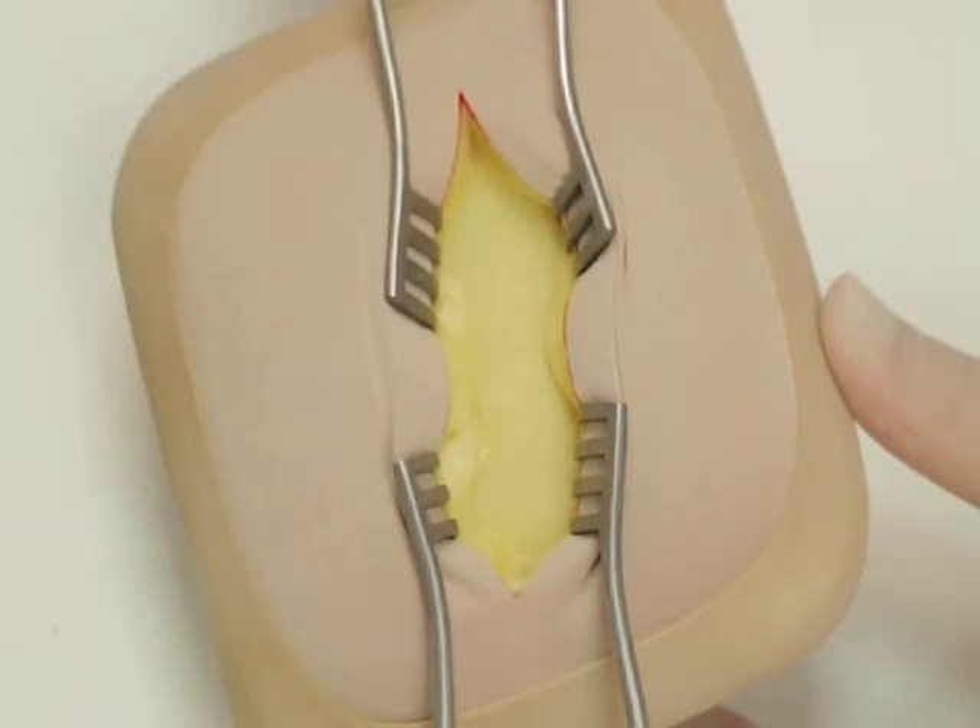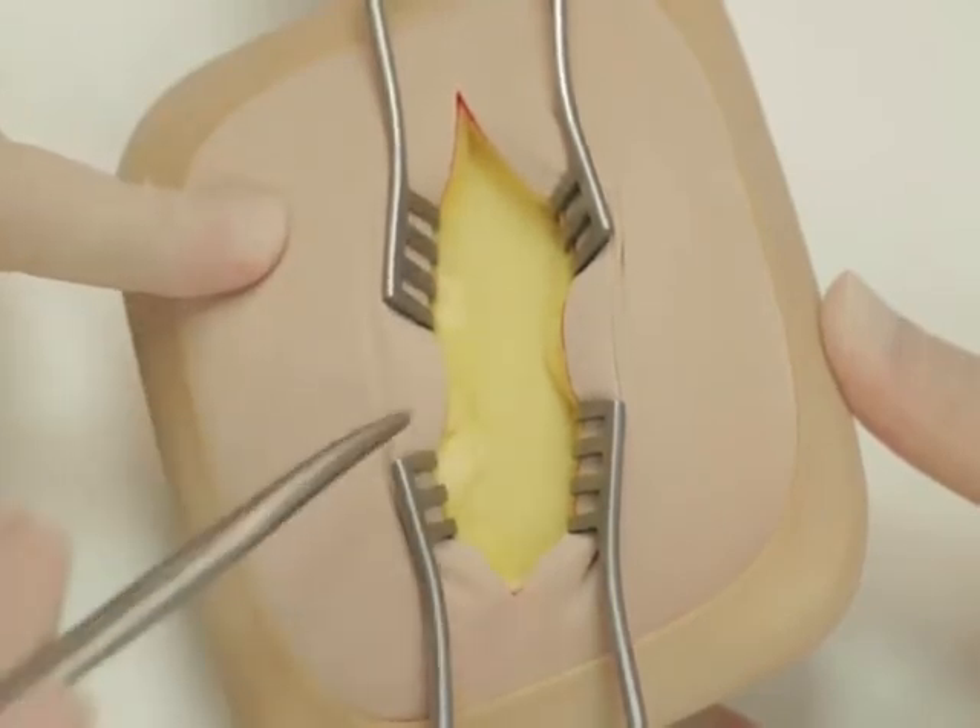This represents the external oblique aponeurosis, which should be divided in the line of its fibres.